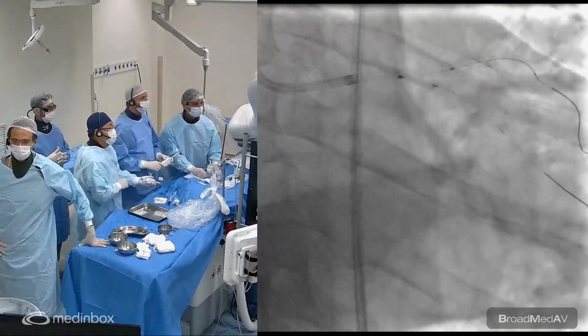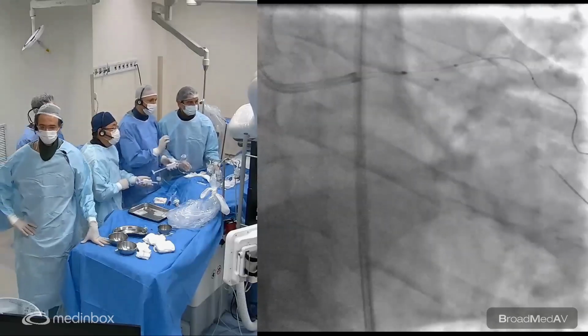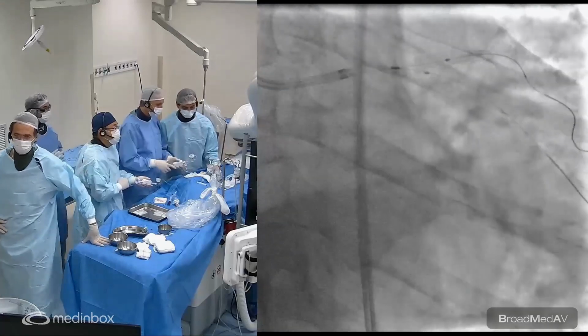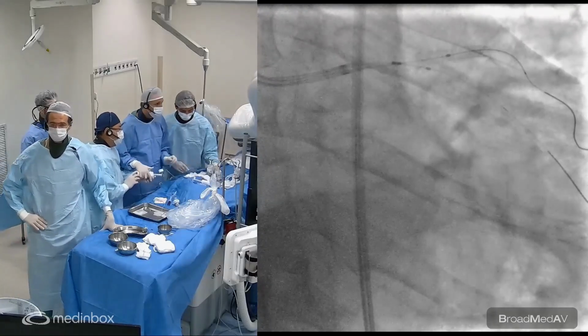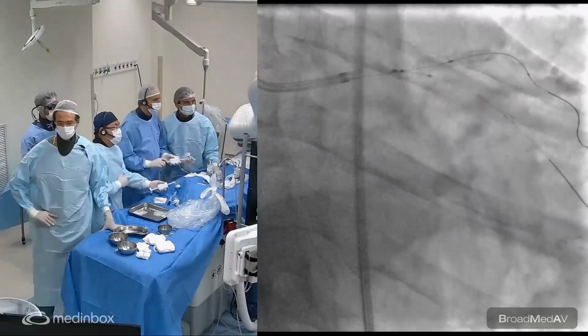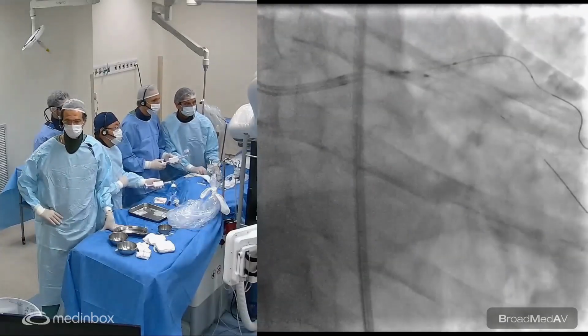Another tip is not to be too proximal in the left main, just as needed to cover the ostium, and to have both markers in the same place all together. Now we have both balloons kissing. So first we go in here with the circumflex. Yes, we're just trying to cover the ostium here.